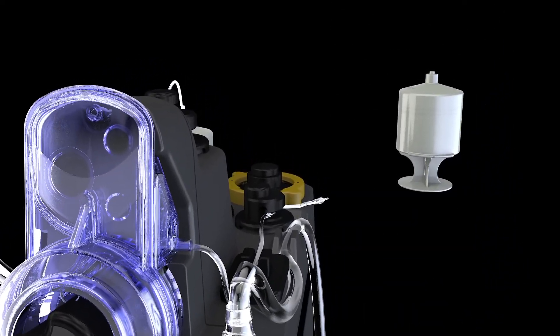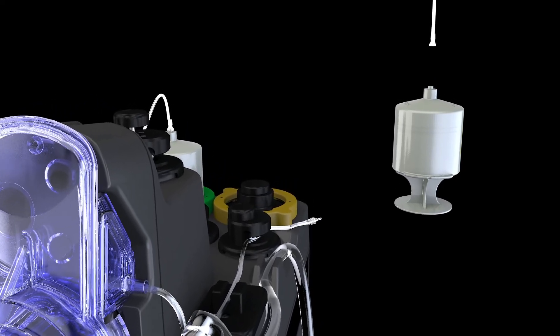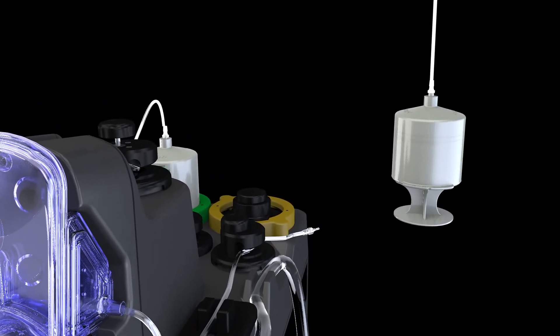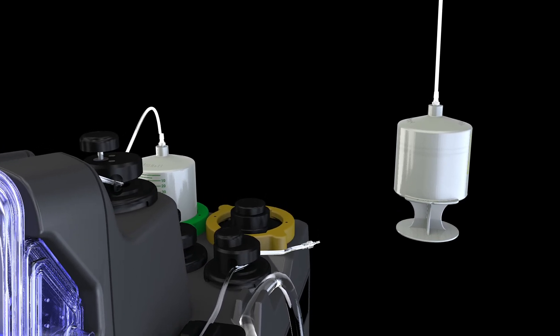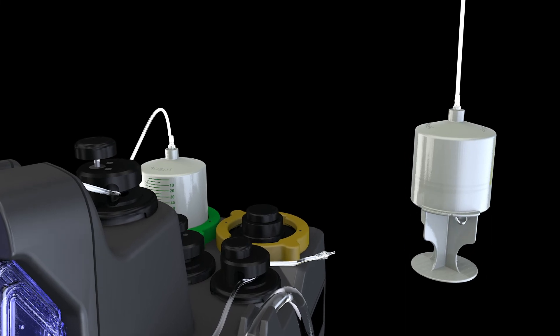Pick up yellow stopcock delivery line, remove cap, and attach non-standard patented lure fitting to arrest cartridge. In a counter-clockwise motion, unscrew and remove plunger end of cartridge and set the plunger aside.